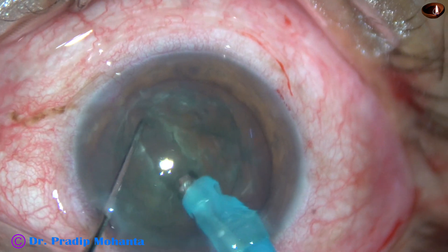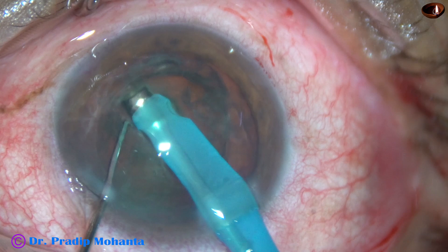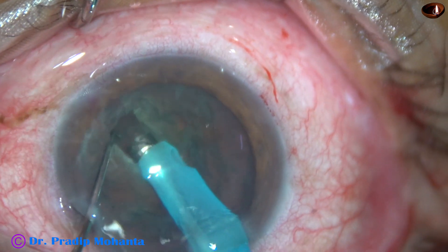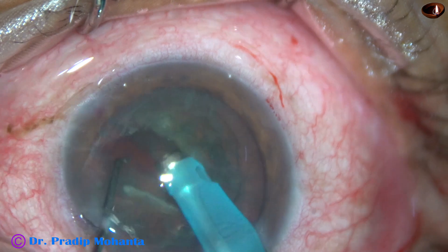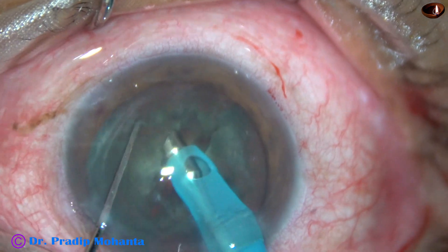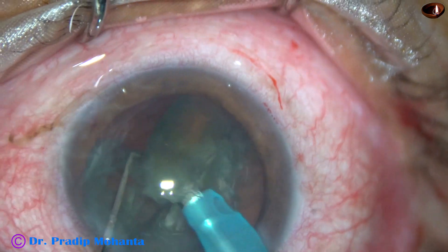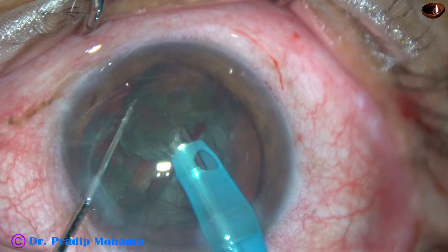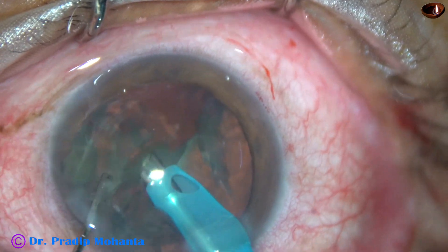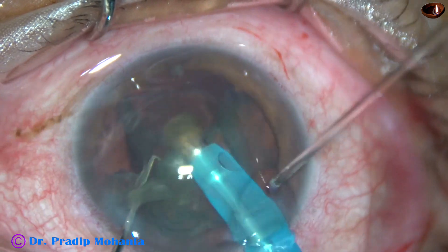So immediately I change my plan. I go to sculpt mode and start sculpting. The direct chop has failed and immediately I changed my approach, doing it by the stop-and-chop technique. By this technique, the nucleus has been divided into two halves. Now I have gone again to high vacuum setting, holding each hemi-nucleus with vacuum and start heating it up. This is the remaining portion of the hemi-nucleus and it is done.